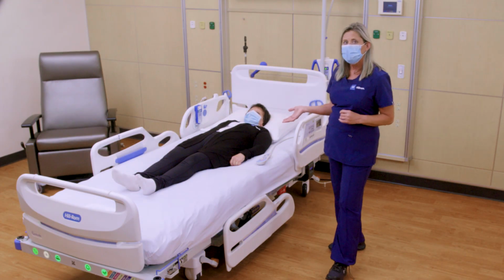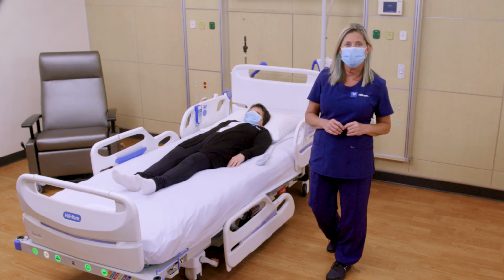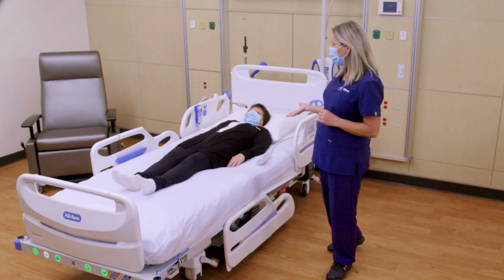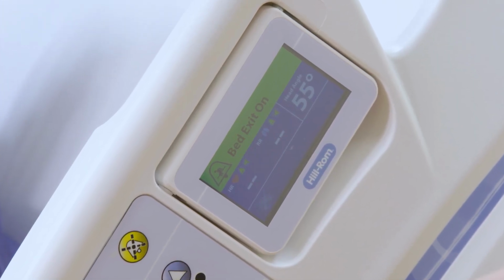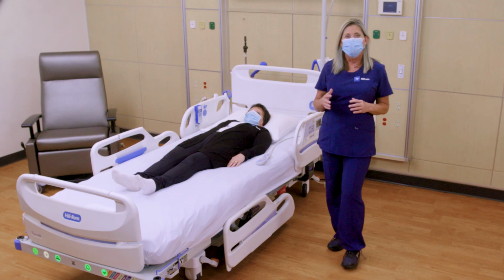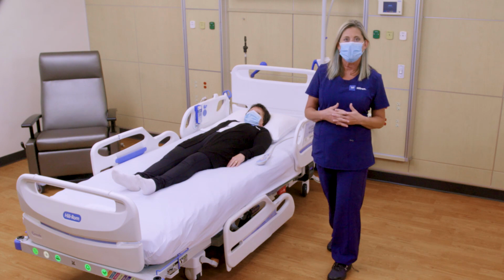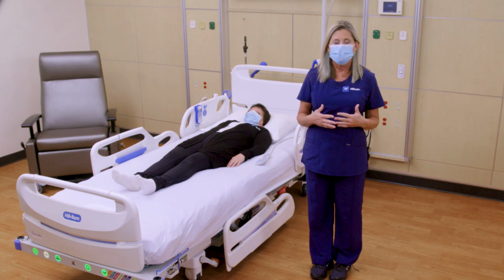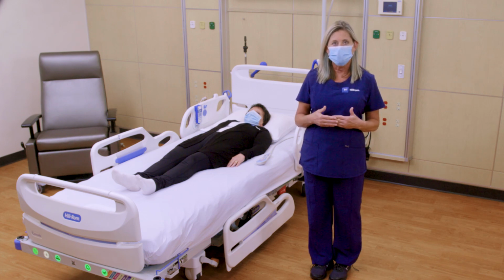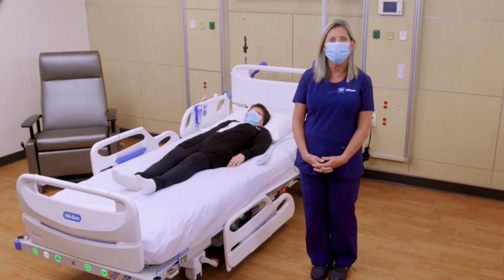In the room, the Navicare Patient Safety application is then going to communicate to the Hillrom Smart Bed. With the patient weight detected, the bed exit engages automatically. When we interact with the patient, I'm going to talk about two scenarios, one using the real-time locating platform for staff locating, and the other interacting with the Hillrom Smart Bed with no locating present.